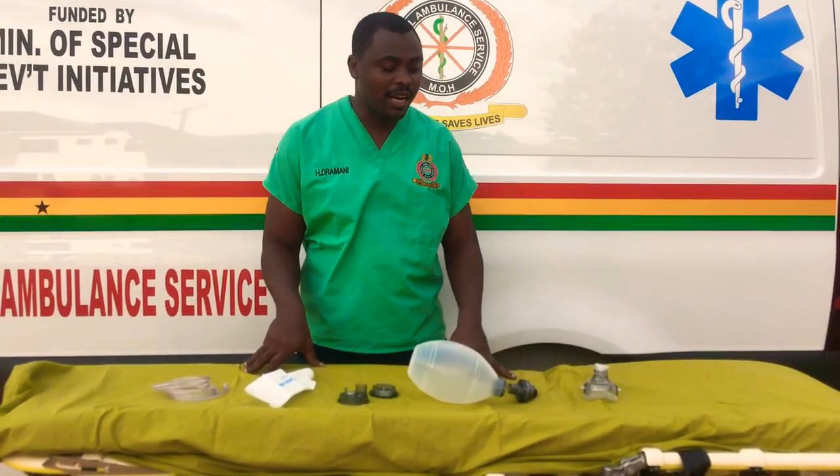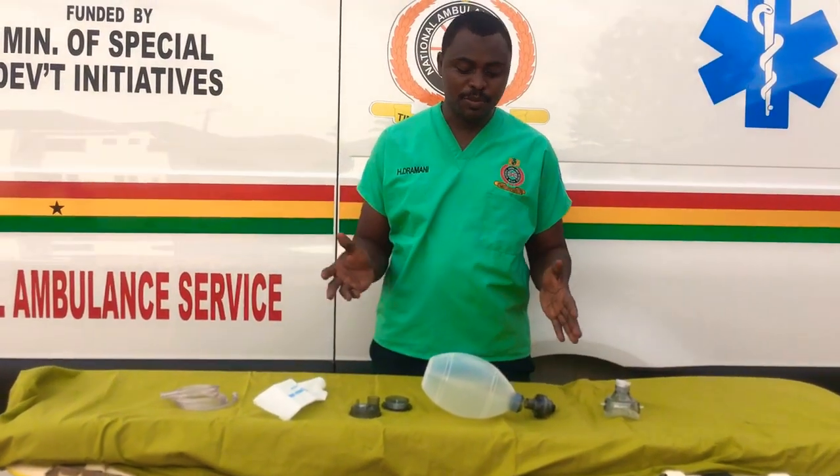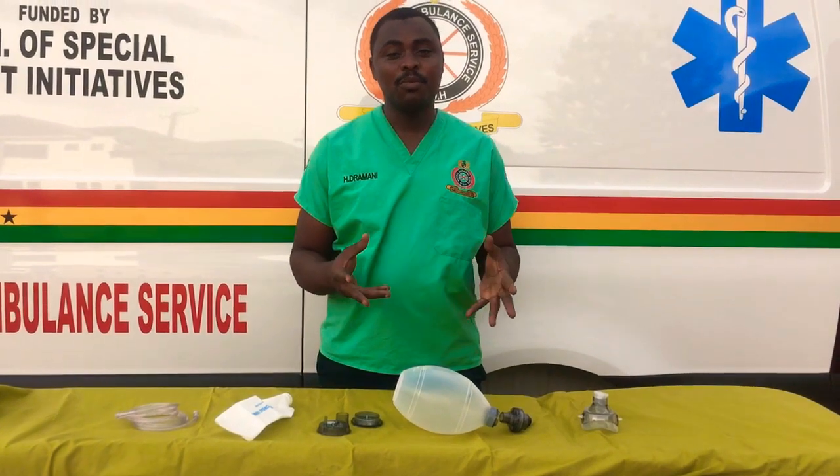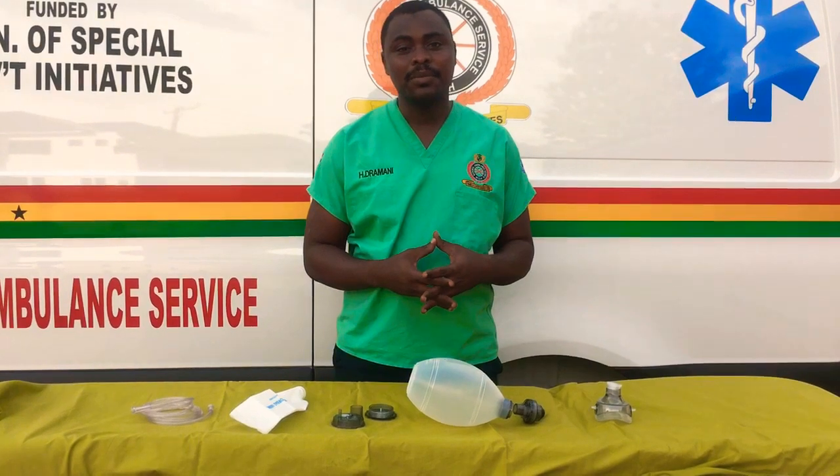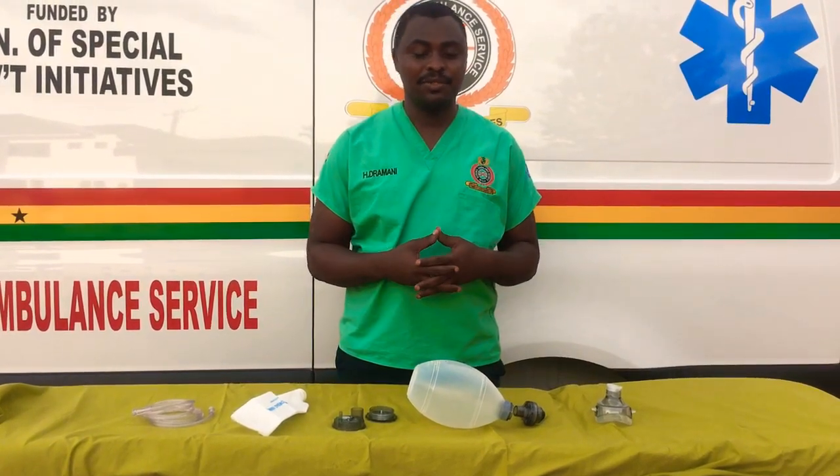Hi, once again. In this video, we're looking at how to know the various parts of an AMBU bag, which we normally call BVM, and then know how to assemble them, and then check whether it's functioning properly.